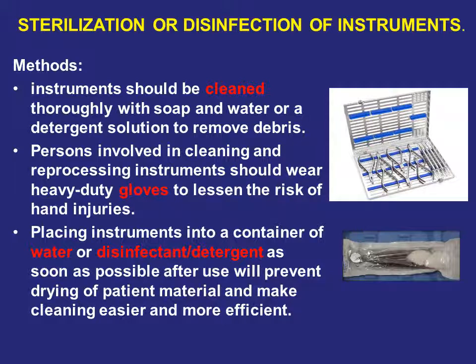Sterilization or disinfection of instruments. All instruments should be cleaned thoroughly with soap and water or any detergent solution to remove all debris. The person involved in cleaning the instruments should wear heavy-duty gloves to decrease the risk of hand injuries. All the instruments after use should be placed in water or any disinfectant solution to prevent drying of the instruments and to make the cleaning easier.